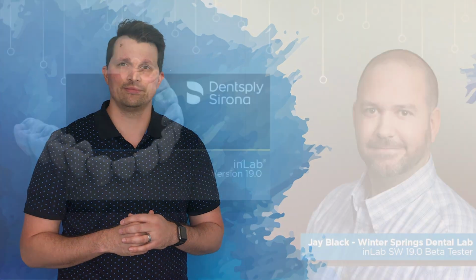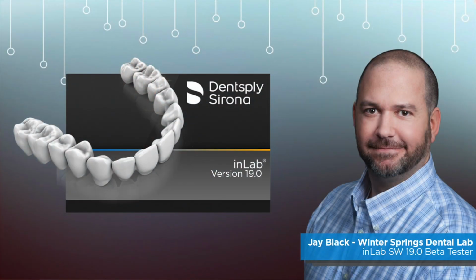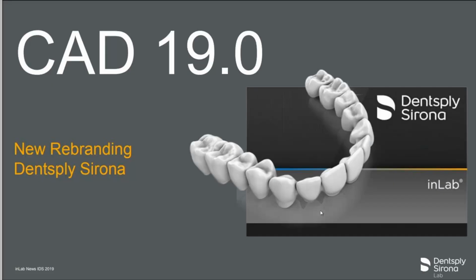I'd like to welcome Jay Black to introduce inLab Software 19 to all of you. Hello, this is Jay Black from the Winter Springs Dental Lab. Welcome to this Facebook Live on the new inLab Software 19.0. Feel free to ask questions in the comments section as we go, and I or Justin will answer them for you. Let's get started. First of all, we're going to have a new rebranding of Dentsply Sirona.